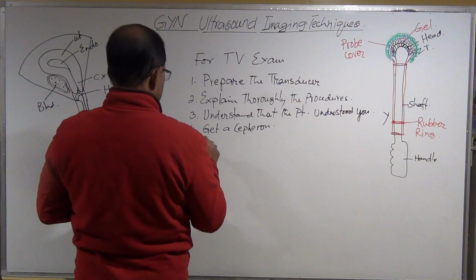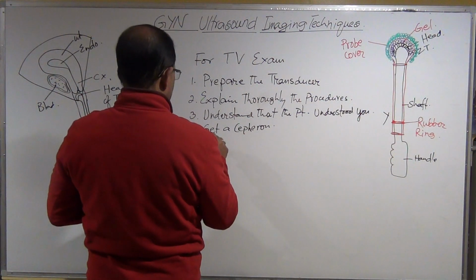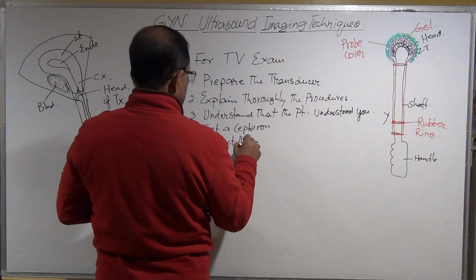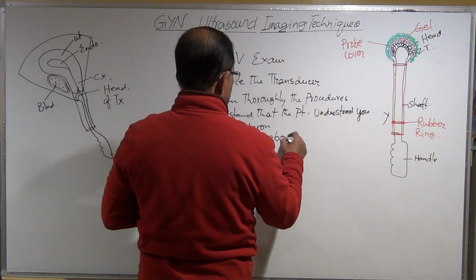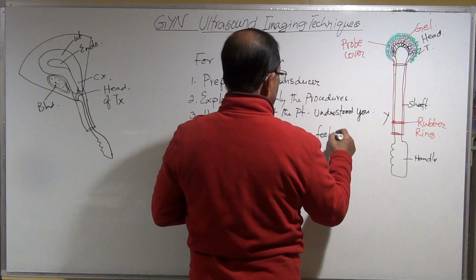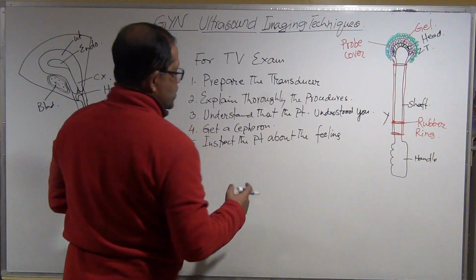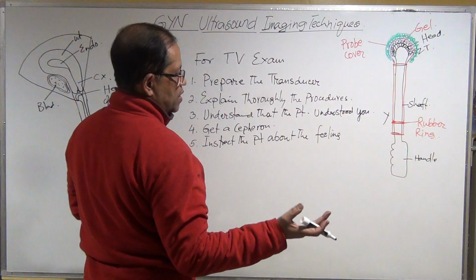And number 5, instruct the patient about the feelings, okay, because the patient can revoke the consent.